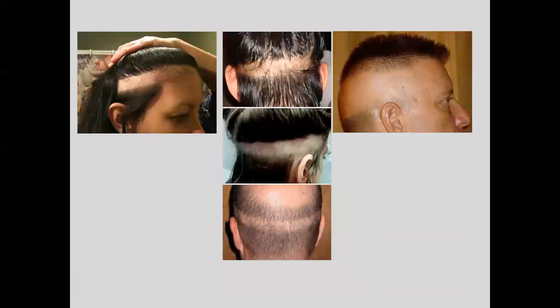And for those of you who don't do fluoroscopy, this is what can happen in CT. These were from stroke scans on a CT. You can see nice coned-in hair loss. I think these pictures came from a study in California. I can't remember which university.